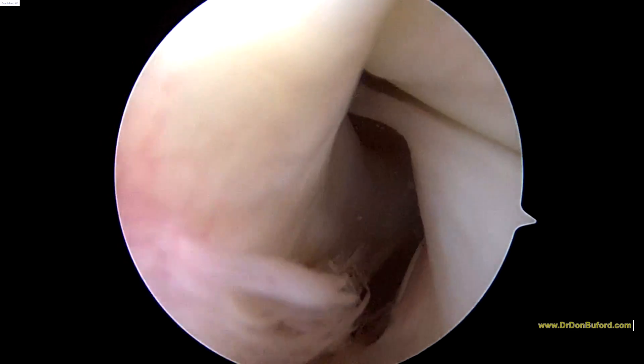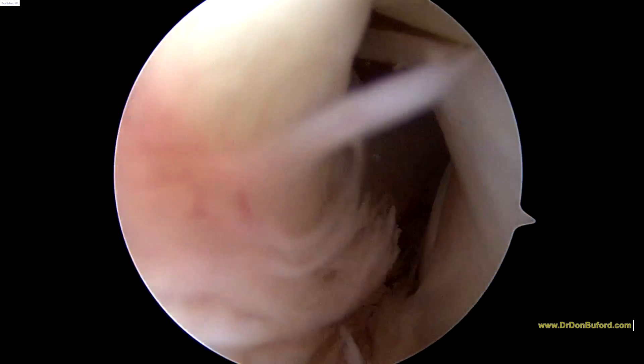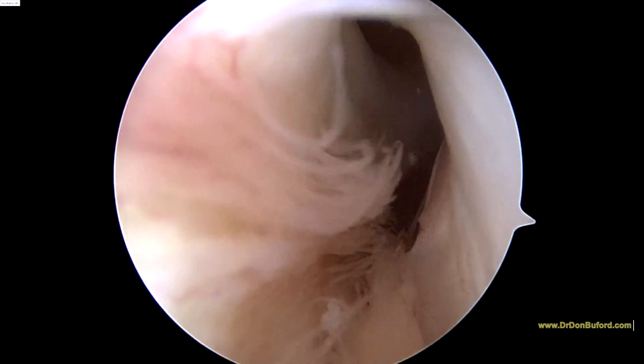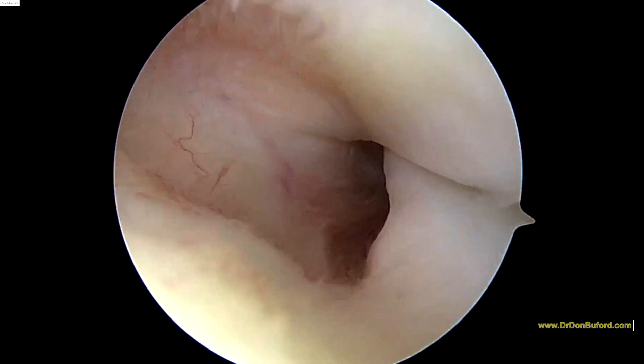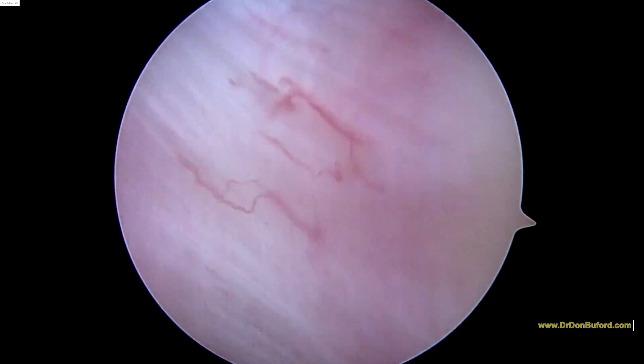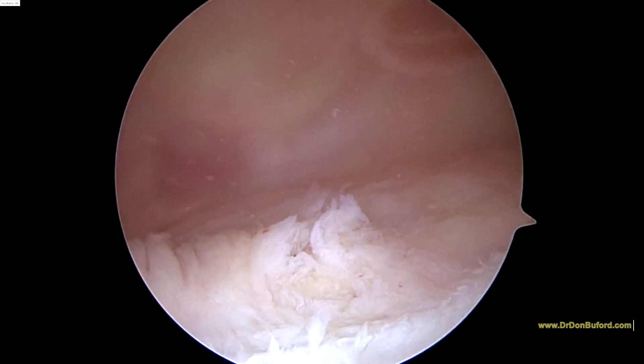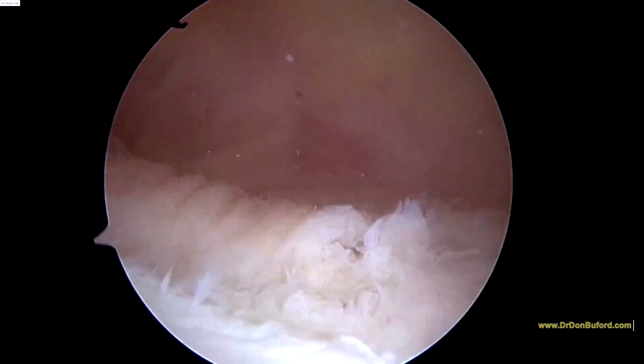So this is the lateral recess. You can see the popliteus tendon. And you can look for any loose bodies — I don't see anything loose down here. That's a place where loose bodies can sometimes hide. Back up into the suprapatellar recess, and so far I don't see anything.